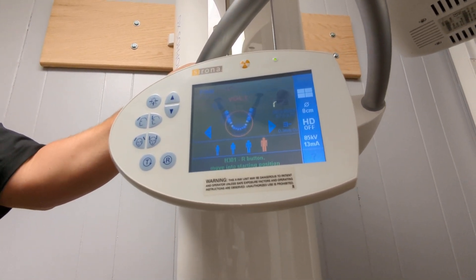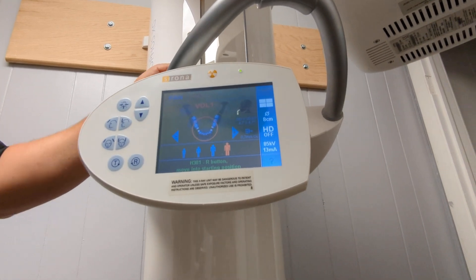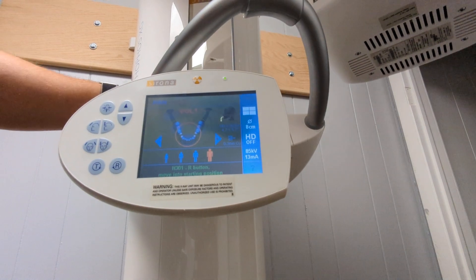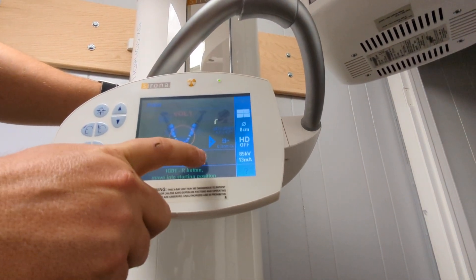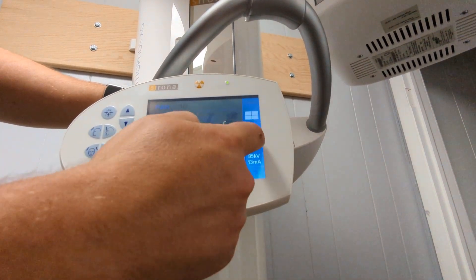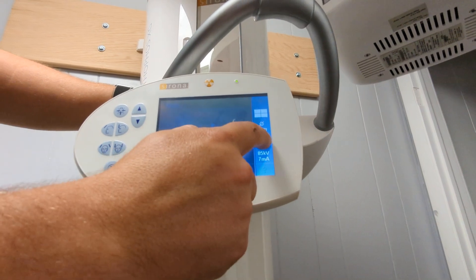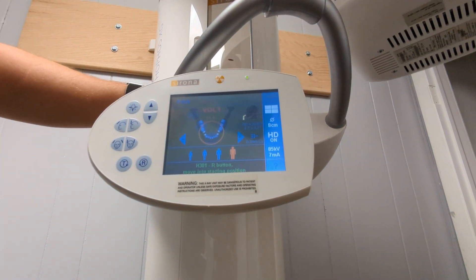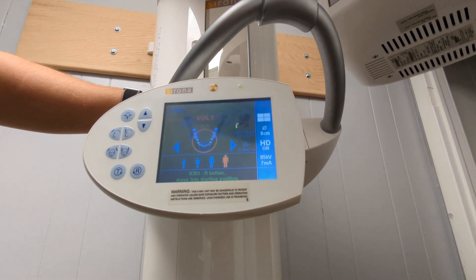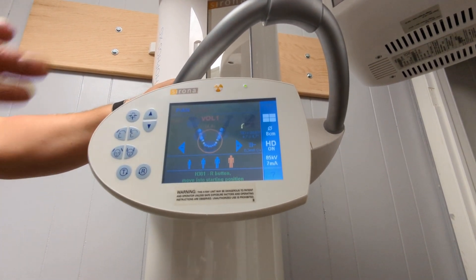I'll teach you something else on panorex — we're going to be a little more specific on that. For 3D, big guy/little guy buttons are fine. Most everybody can be between those two unless they're a child; if they're a child you can go to one of these lower ones. HD should always be on. Press that and that's about it for 3D — it's pretty easy.